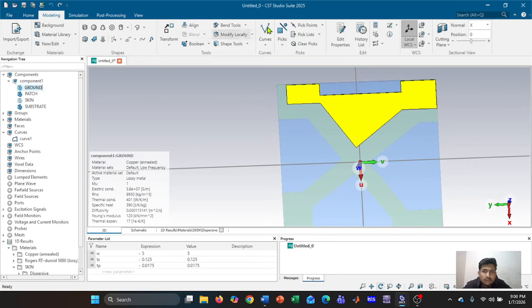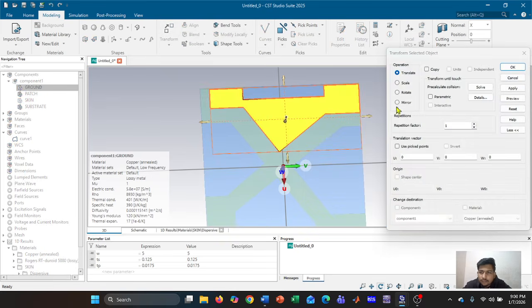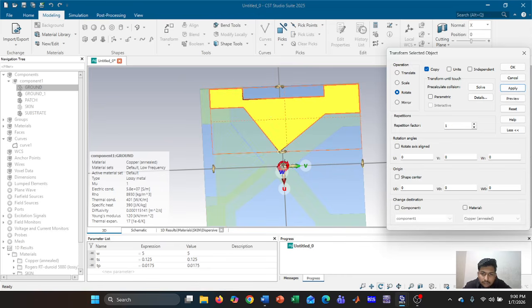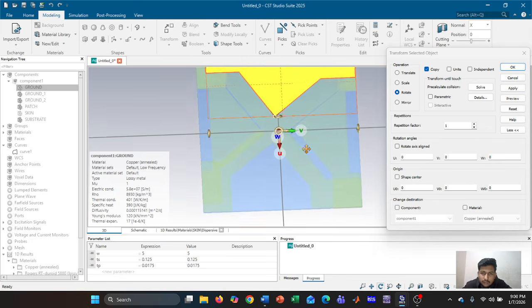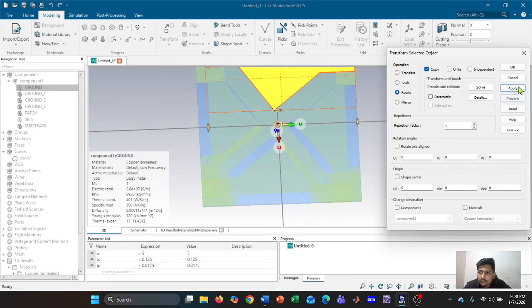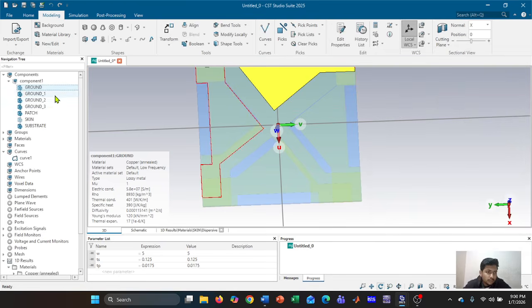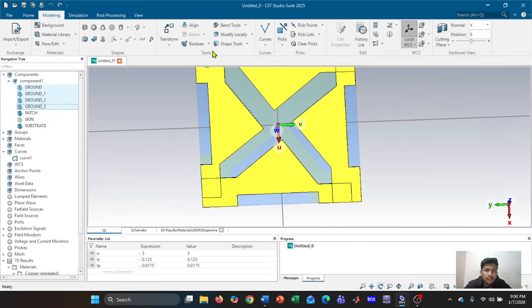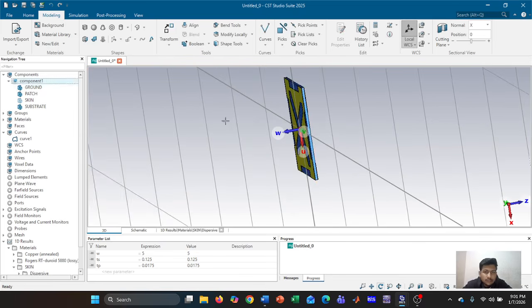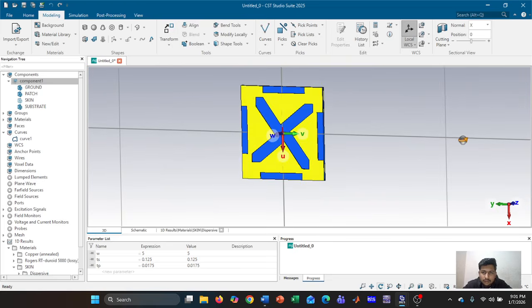Again select this, transform, rotate and copy, apply. I need to make it on every side. Okay, now I'll connect those together. So you can see this is my main patch and this is my ground patch.